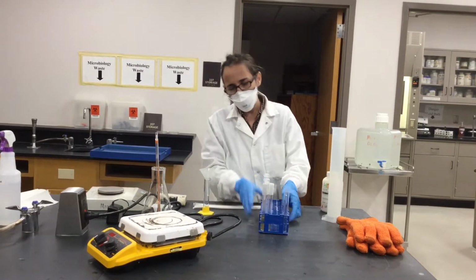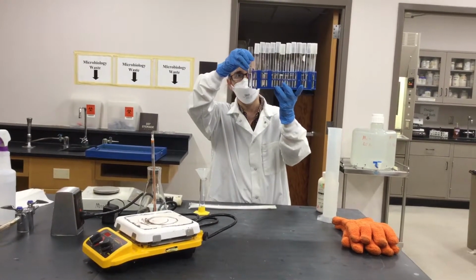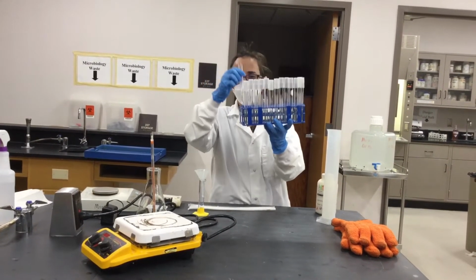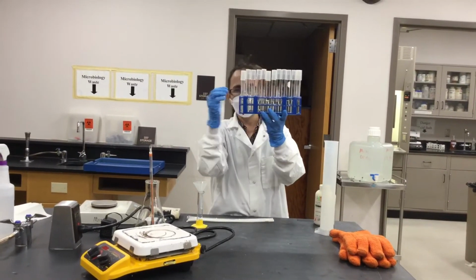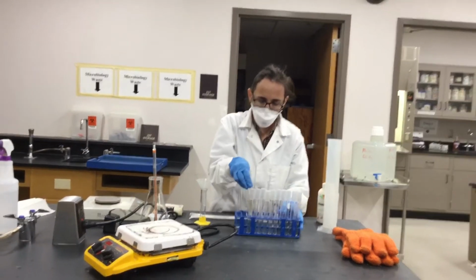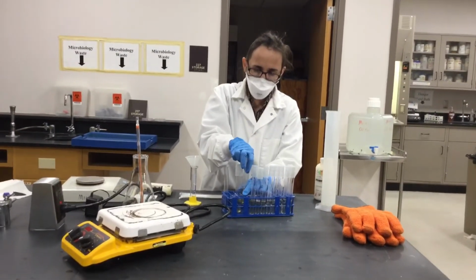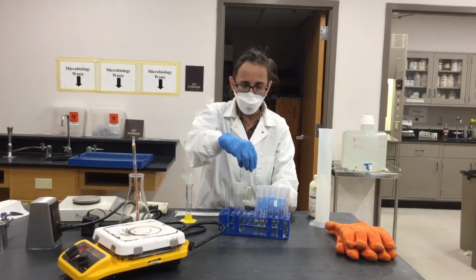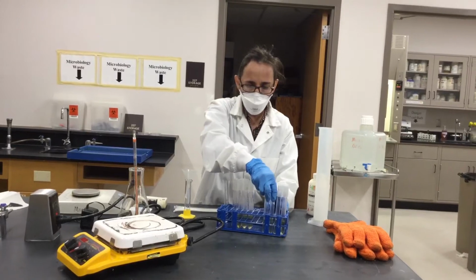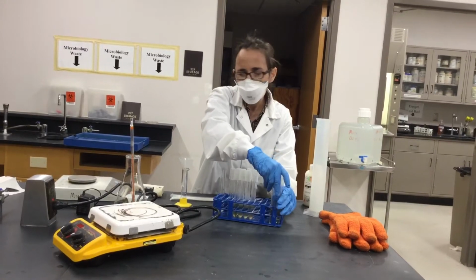since I have it in one edge, when I was dispensing this media, I had this template of water on one side, and I used it to go across these empty tubes to have an eye level of where to go. But I don't want to have them on the edge, so I'm going to put them here on the center of the rack, so it will be more stable, with one edge being of almost equal weight as the other one, so it doesn't tip over, which if you're careful it shouldn't.